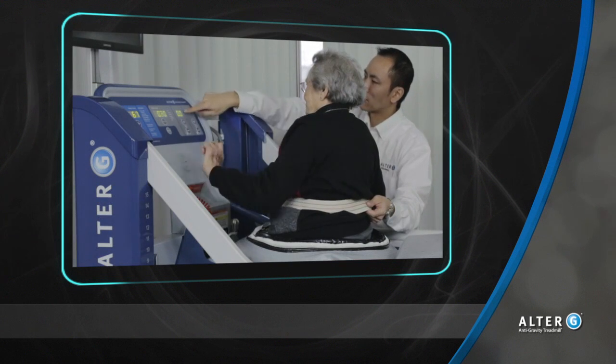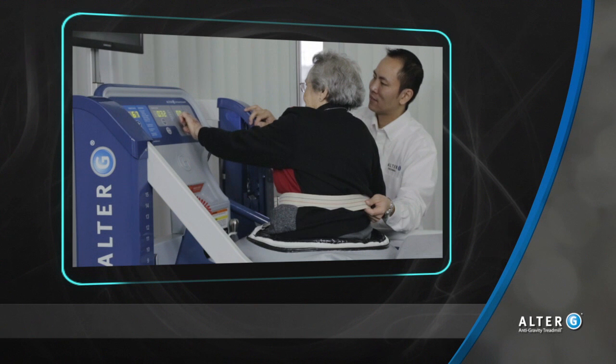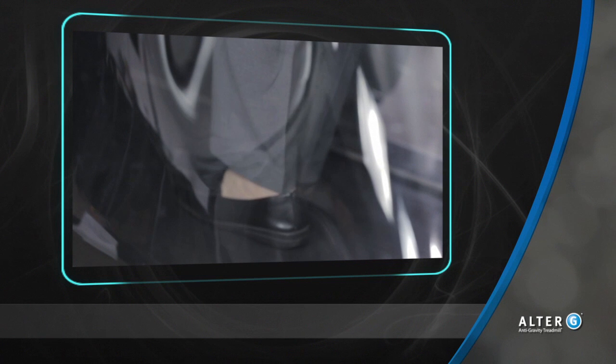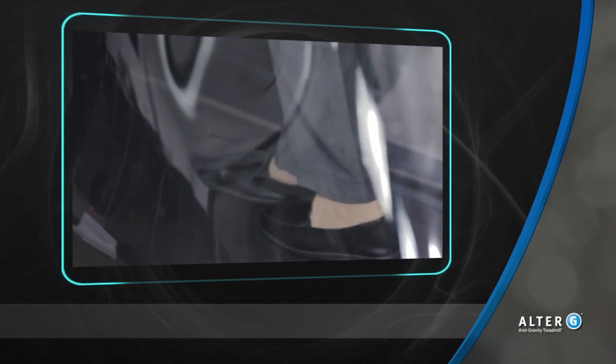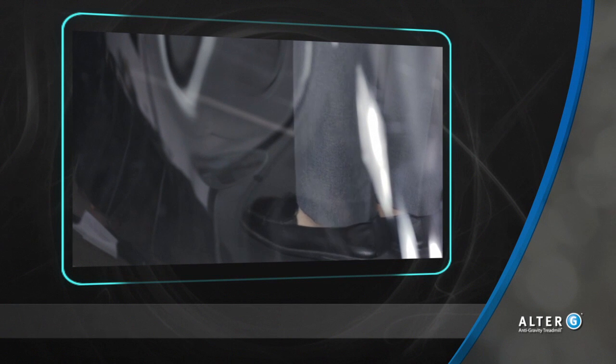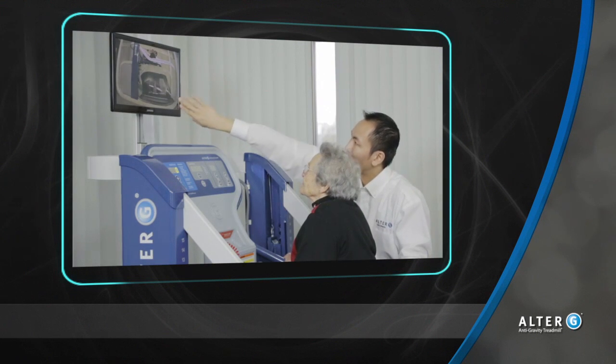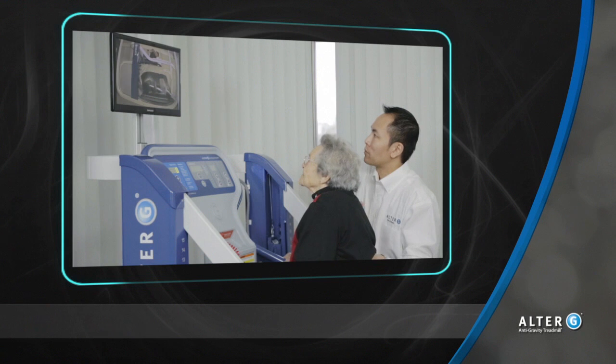The Alter-G anti-gravity treadmill operates as any conventional treadmill would. If a user pushes backwards or forwards on the belt, it will slowly move. To counteract this, remind the patient to stand still with their feet underneath them. If the belt begins to slide before calibration, use the gait belt to support the patient and tell them to lift their legs up like they are marching, and reposition their feet under their body. Trying to push backwards will only accelerate the belt movement.